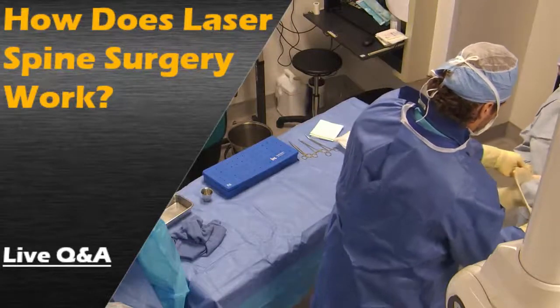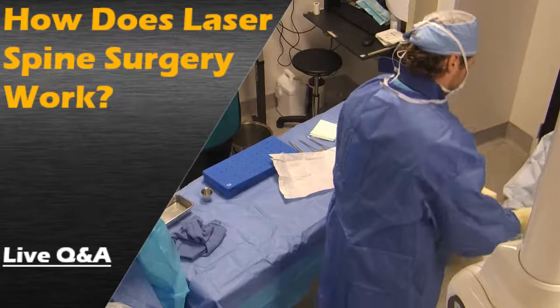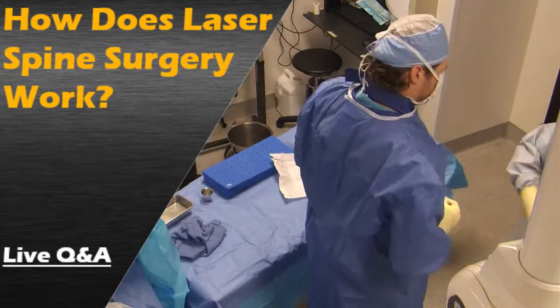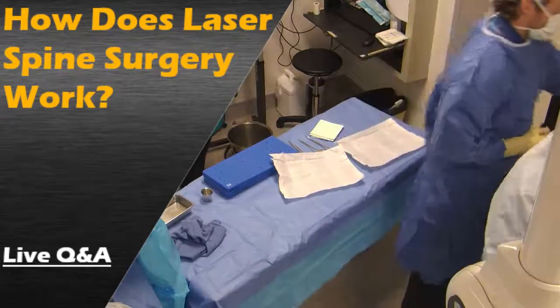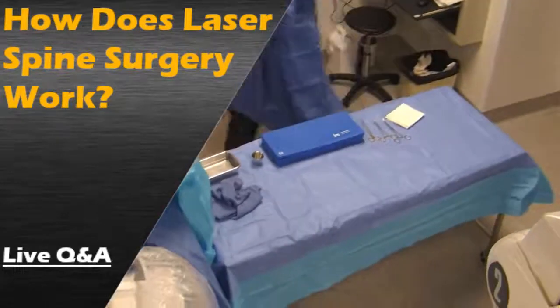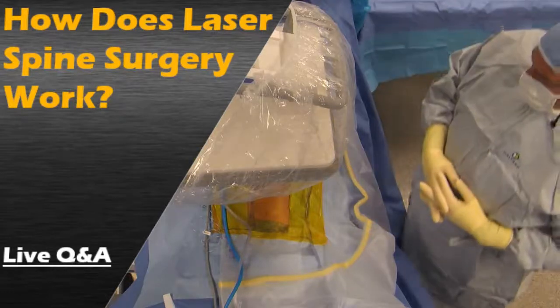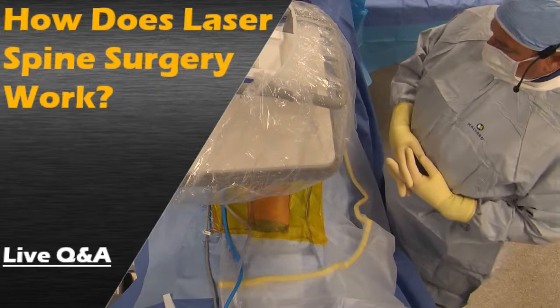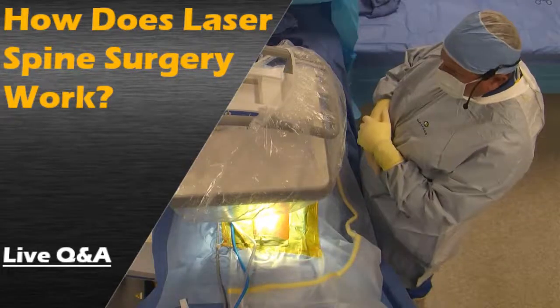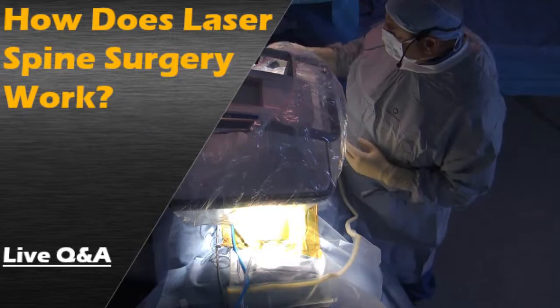We are broadcasting live spine surgery from the operating room at Duke Spine Institute and the Surgery Center of Vieira. Our second patient for the day will be another endoscopic Duke Laser Disc Repair. The patient has a herniated disc with a spondylolisthesis at L4-5, grade one. Most surgeons would do a fusion surgery with decompression because he has leg symptoms. This patient did not want a fusion — he wanted something less invasive. The Duke Laser Disc Repair is the least invasive surgery in the world to fix back pain and leg symptoms from a herniated disc or spondylolisthesis.